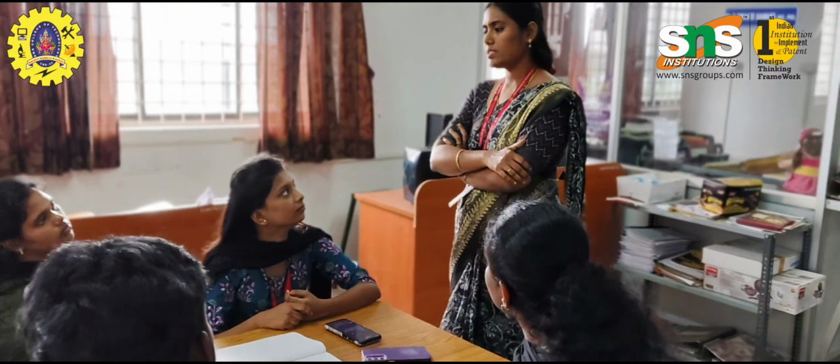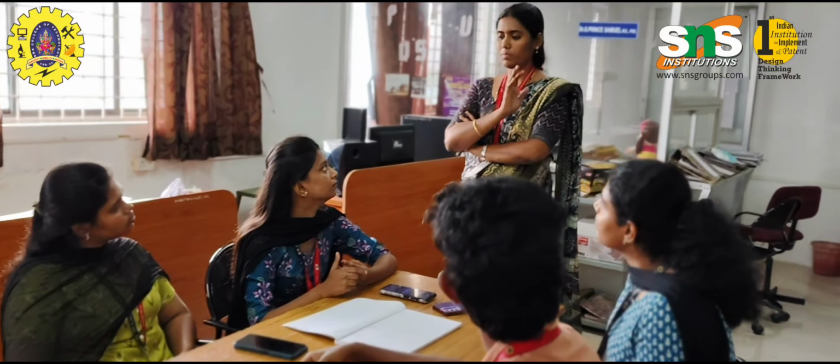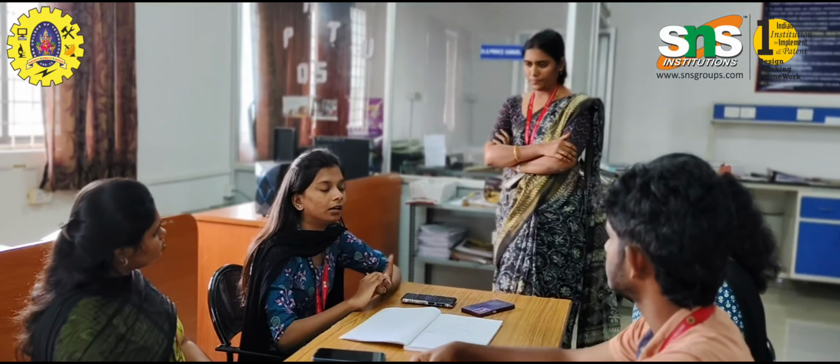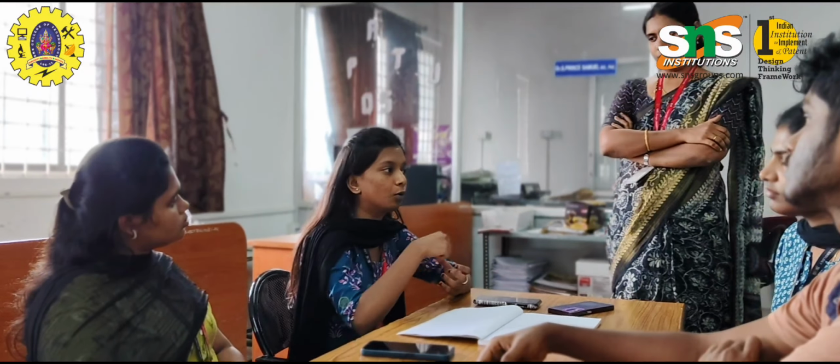Yes, now I have one question. Why is a patient electrode recommended in the unipolar method and why is it not used in bipolar? In what way is it important? Actually, the patient electrode or the grounding pad ensures that whatever current we send is closed.